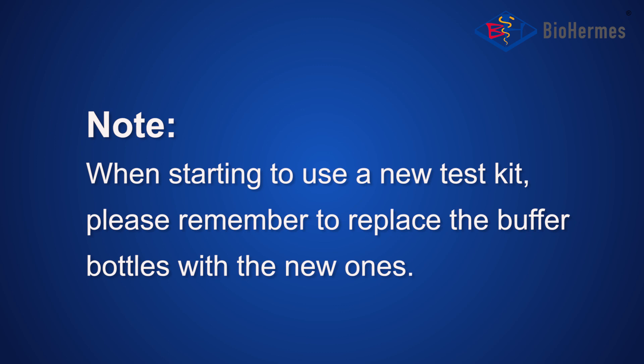Press the rinse icon to rinse the internal pipes. When starting to use a new test kit, please remember to replace the buffer bottles with the new ones.